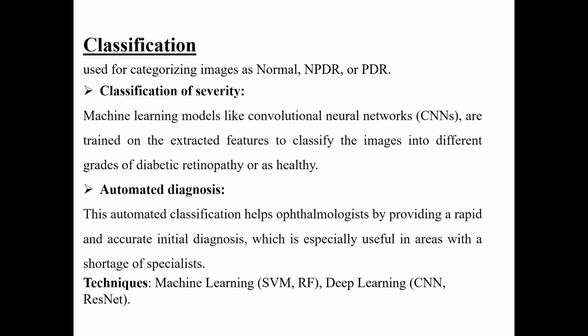So what we can conclude based upon the discussion is that deep learning, especially CNN architecture, is used for analyzing thousands of retinal images and learning patterns that even in the rarest cases experts might miss. So if you train the algorithm in a very efficient way, it is going to be very helpful for the diagnosis.